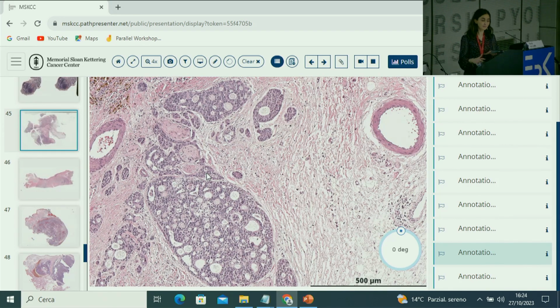But some people may say this is a squamous or a spindle cell squamous carcinoma arising in addition to adenoid cystic carcinoma. I don't think we did MYB fusion on this, but I think it has a typical morphology, and this is really the real high-grade transformation or dedifferentiation.